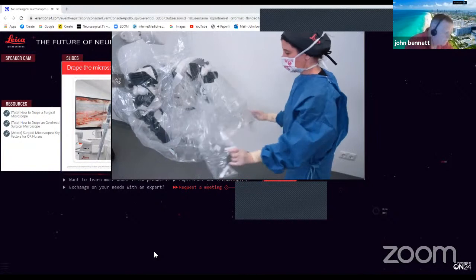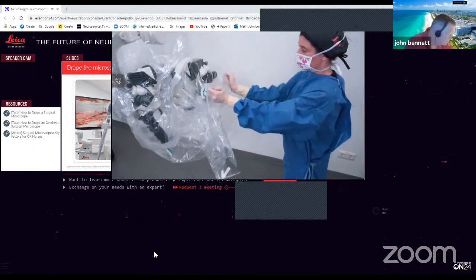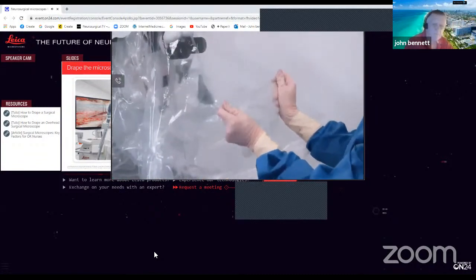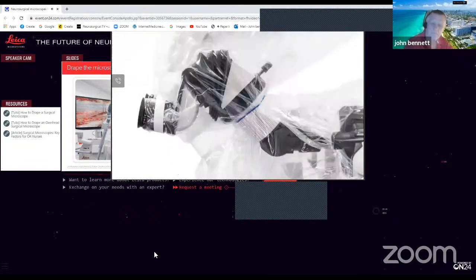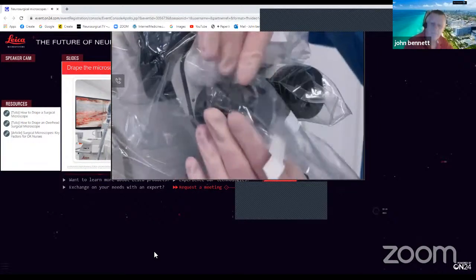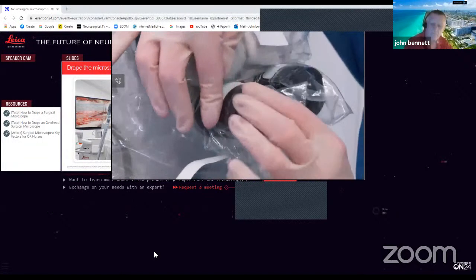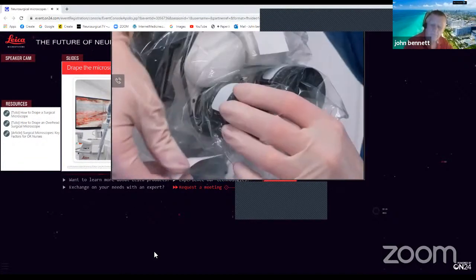It's now time to drape the eyepieces. The drape has several eyepiece covers. Choose the middle one from the 3 facing you to drape the surgeon's eyepiece. Then use the other ones, depending on the number of eyepieces to be draped. Be careful. The eyepiece drapes are perforated at their end. It is important to be gentle in order to avoid any detachment.